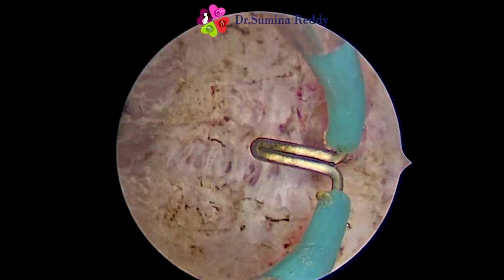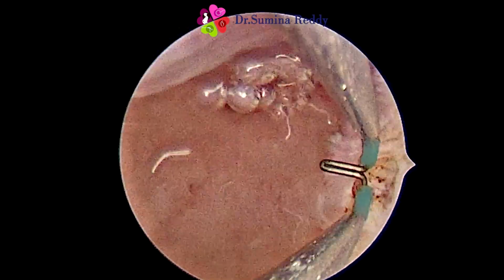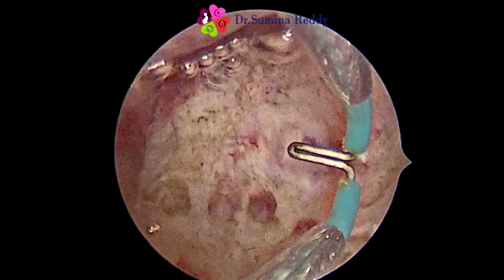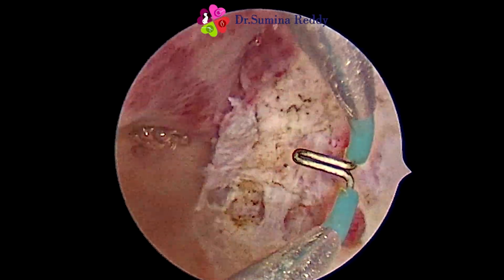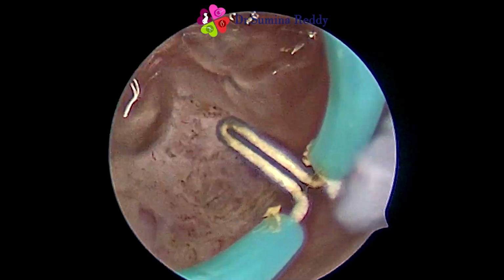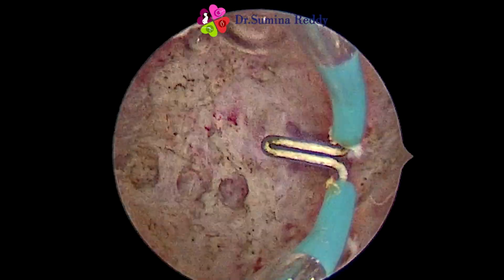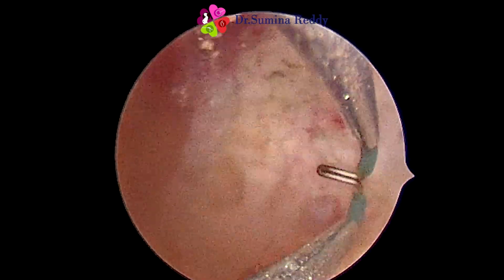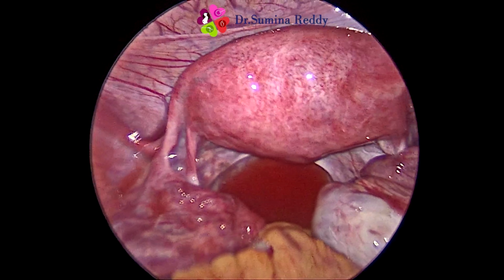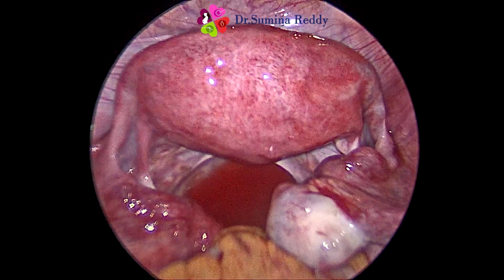Resection has to stop when both the tubal ostia are clearly visible at equal depths and the lateral wall contour is symmetric. Avoid going too deep where the myometrium may get thinned out, to prevent perforation of the uterus. We can use either transabdominal ultrasound or laparoscopy guidance to guide us about the depth of resection.